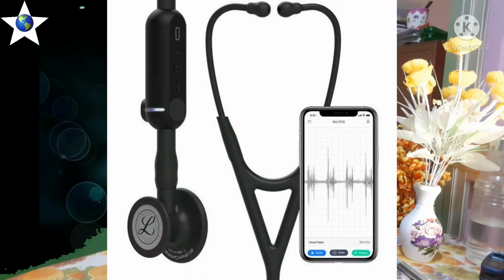Stethoscope means Littmann, and there are various models of Littmann: Classic 3, Cardiology 4, Master Cardiology, Core Digital. So various models are present, and this is Cardiology 4. Core Digital is the highest edition, the latest edition, and you may hear about the amplified sound. Did you hear? Amplified sound means the sound is amplified by an amplifier placed in the stethoscope. You charge this amplifier with a charger, and then you hear the amplified sound. But I have this Cardiology 4.